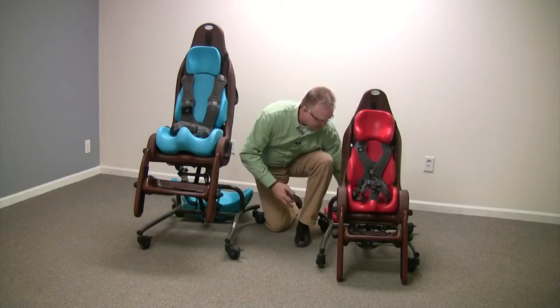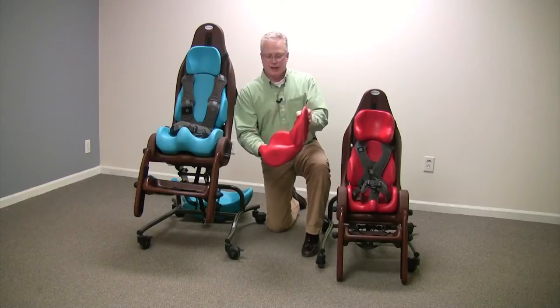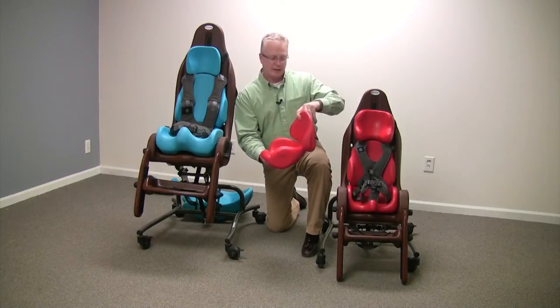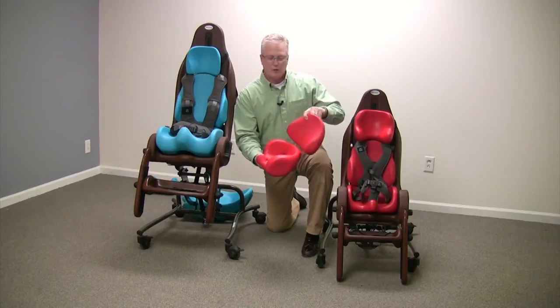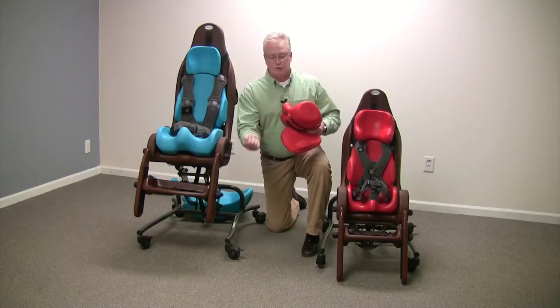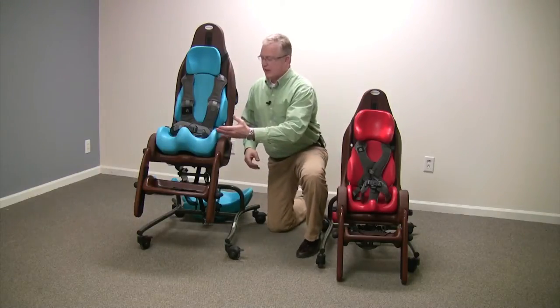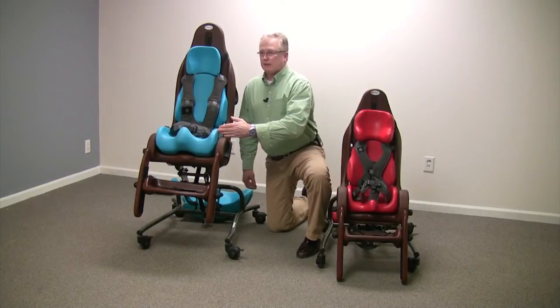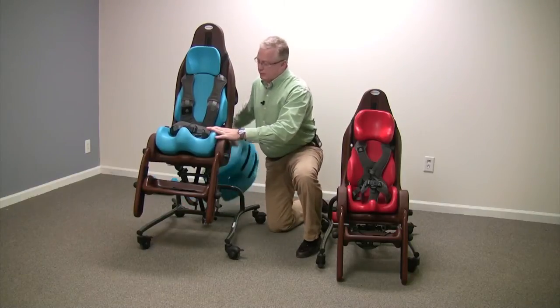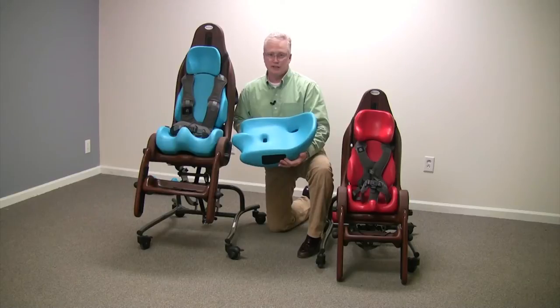The small can take a child all the way from a six-inch seat depth, which is really small, with your choice of back — it also offers two backs — all the way up to a seat depth of 12 inches. So as the child grows, all you do is switch the cushion. The large has an 11 to 17 inch seat depth range.